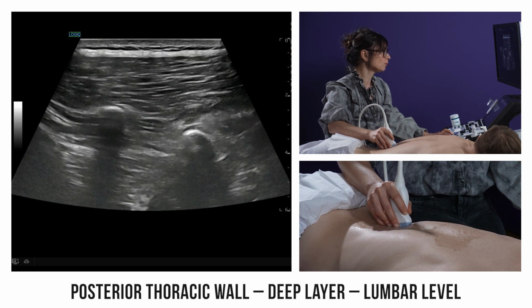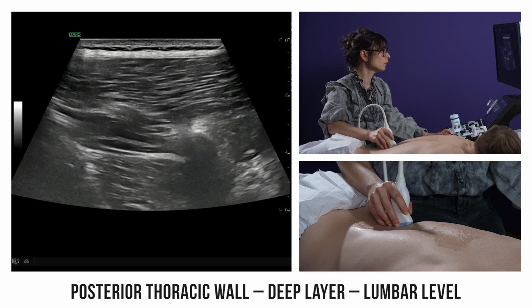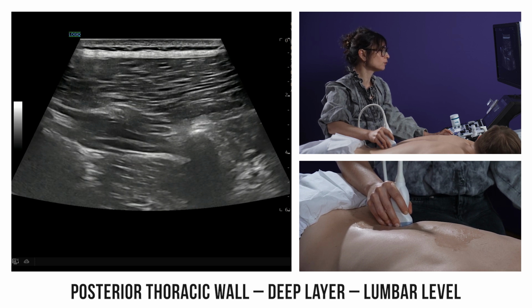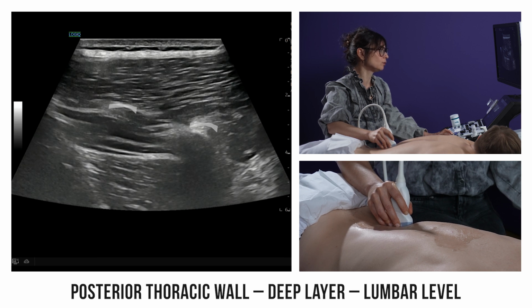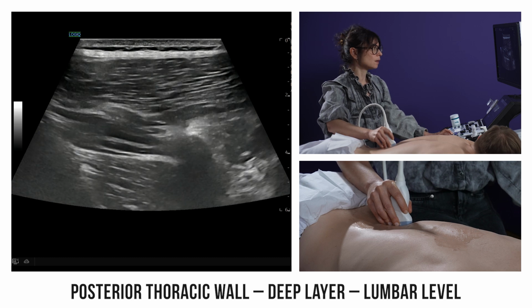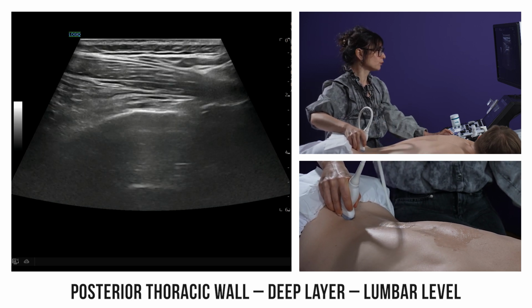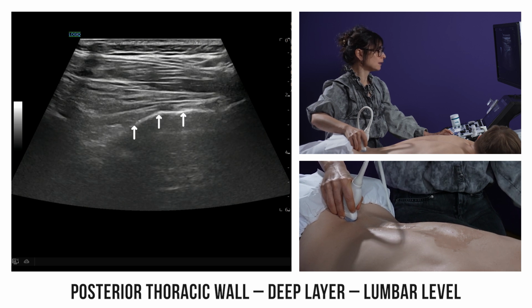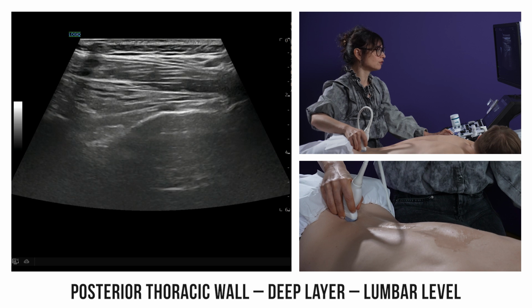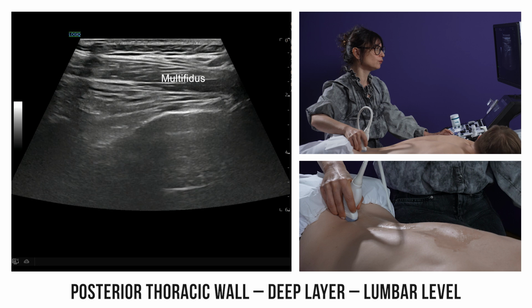Moving further laterally again, we reach the transverse process, beneath which the fibers of the iliocostalis and the longissimus intermingle. If I move very deep at the level of the sacrum, we see the sacral slope. Here, the muscle giving rise to the broad aponeurotic muscular insertion is the multifidus alone.